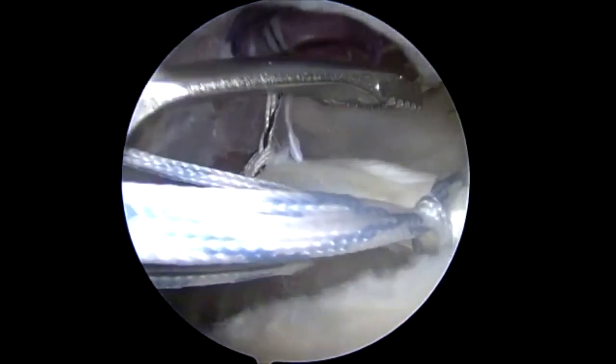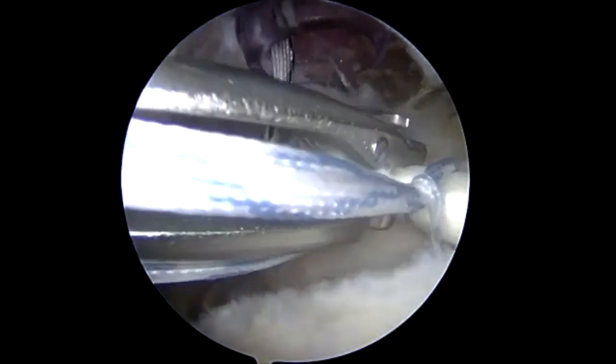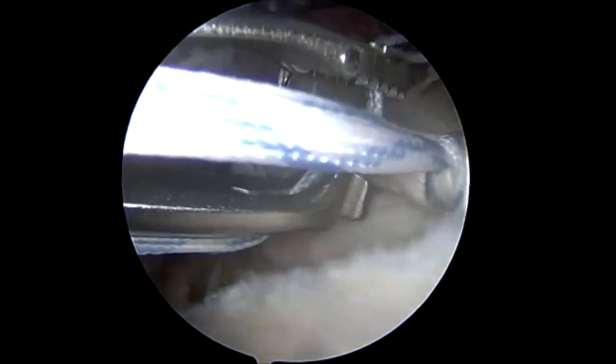Next, a tack stitch is placed through the biceps tendon distal to the loop using an antegrade suture passer to complete the loop-and-tack construct.